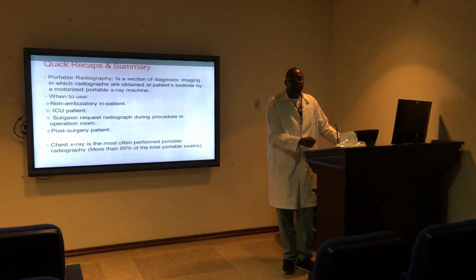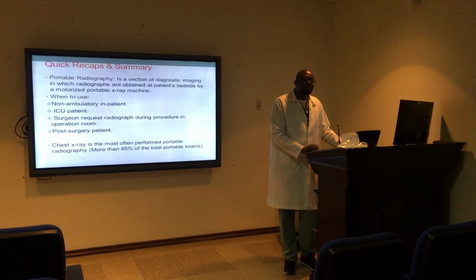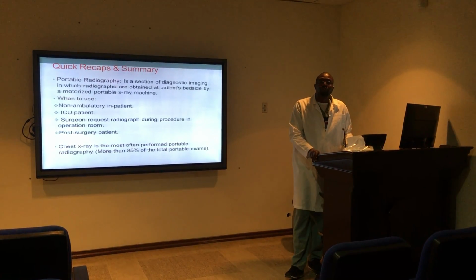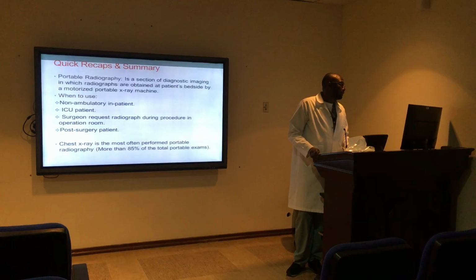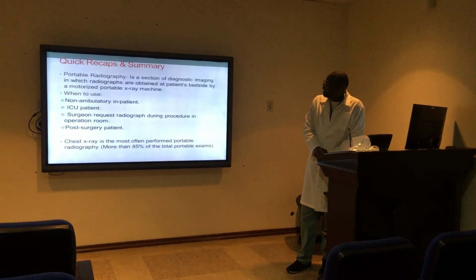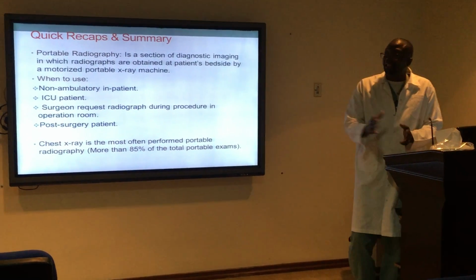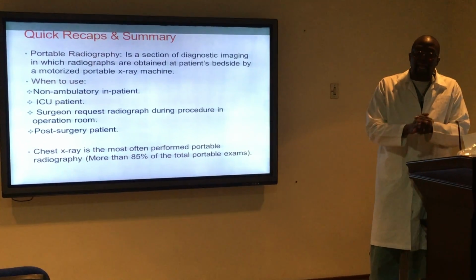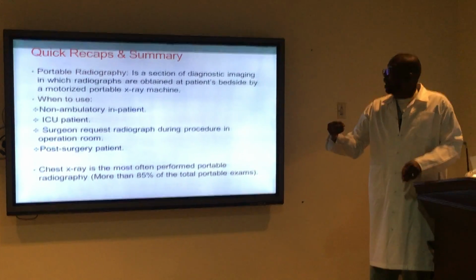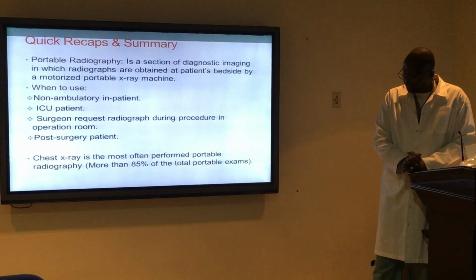Before we go into today's lesson, I would like to do a quick recap and summary of our last lesson on introduction to portable radiography. Portable radiography is a section of diagnostic imaging in which radiographs, X-rays, are obtained at patient bedside, inside the patient room, with a motorized portable X-ray machine.